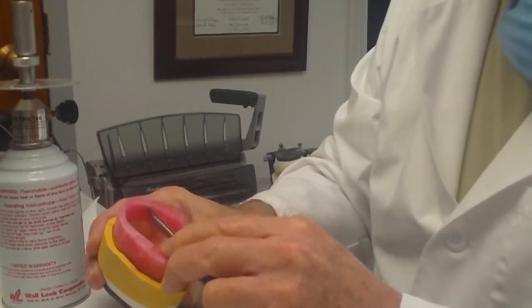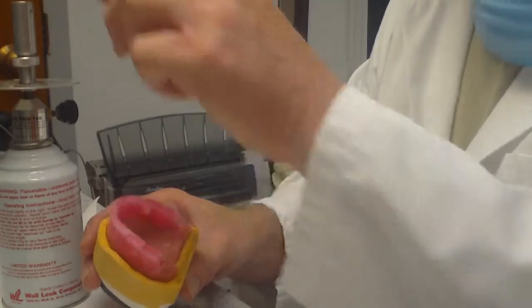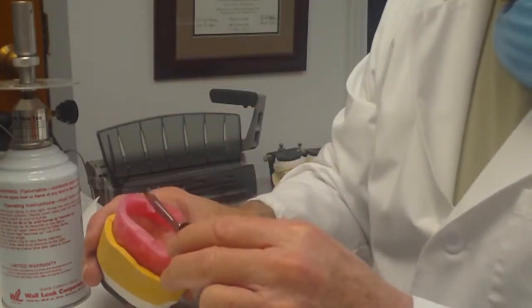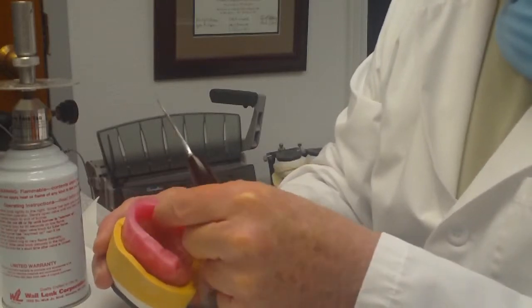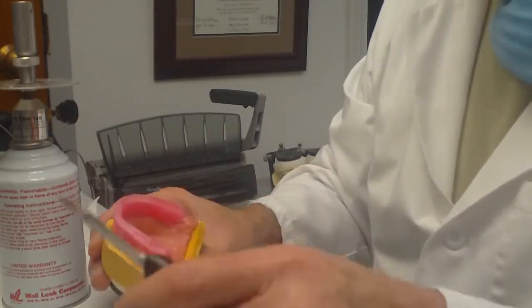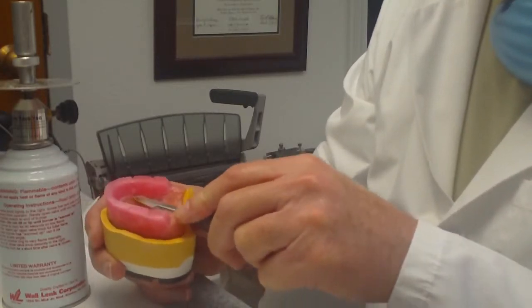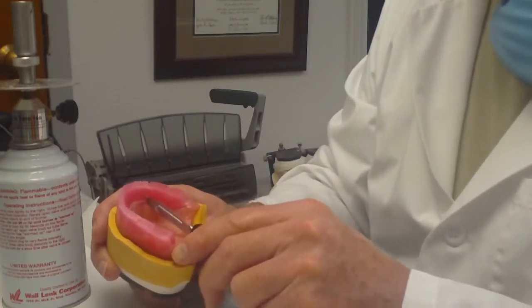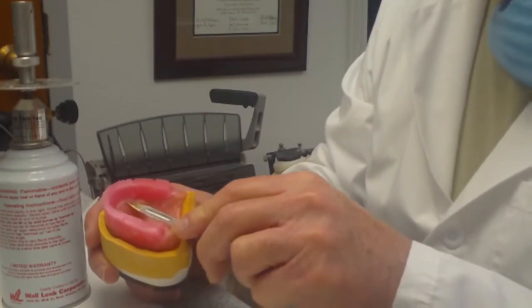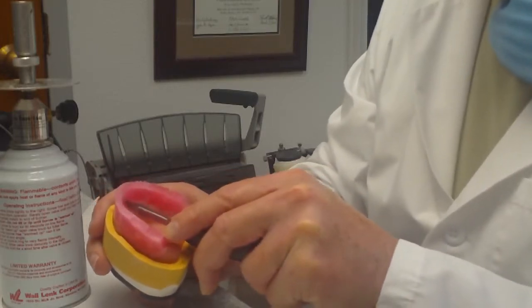So as I see, I can use just a hot blade and section through there, and I'm cutting out an area hopefully large enough to set the central incisor, the lateral incisor, and the canine on one side of the arch, in this case on the right side, or I'm sorry, the left side, and then we'll set the teeth on the opposite side.